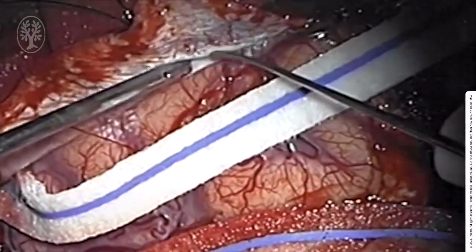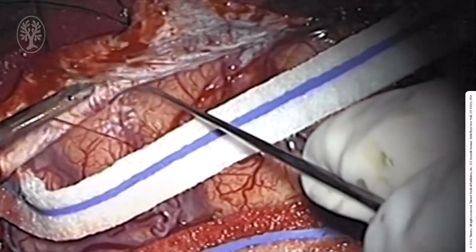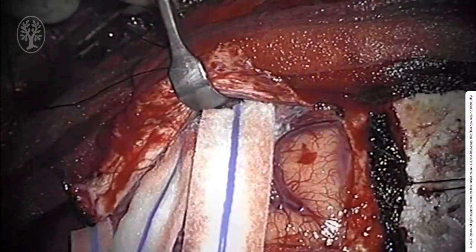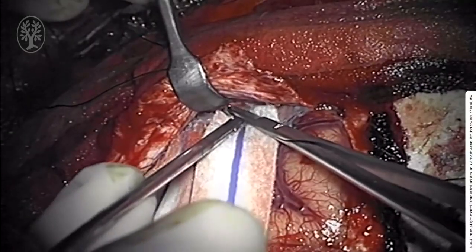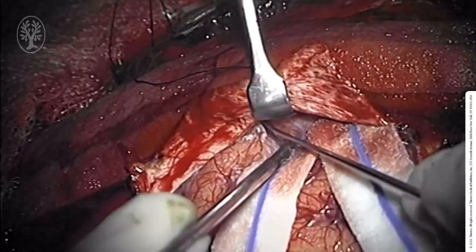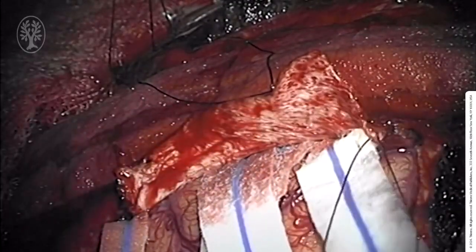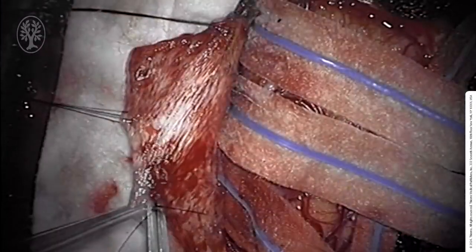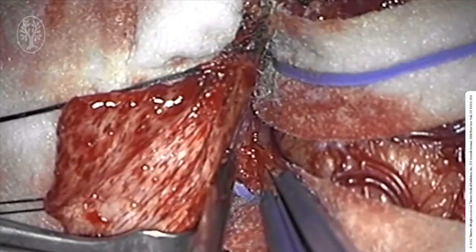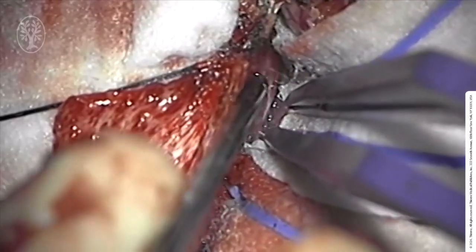Before retracting the sinus and falx, the underside of the dura is inspected for arachnoid granulations or other pial adhesions. After these are divided, the dural flap is used to retract the sinus and falx towards the contralateral hemisphere. Over-retraction may result in occlusion of the sinus. Tack-up sutures through the dura assist with its retraction. The initial dissection follows the firm border of the falx medially.